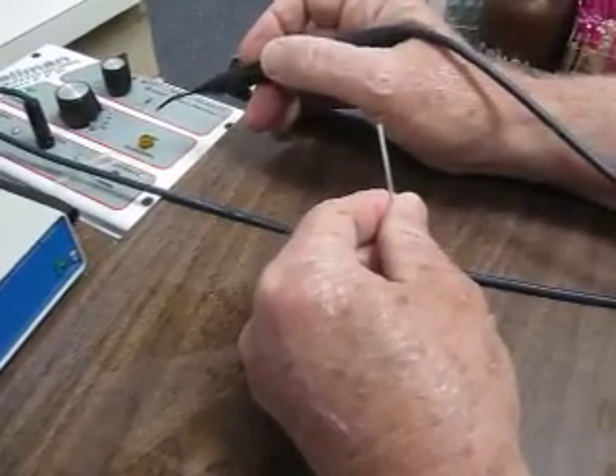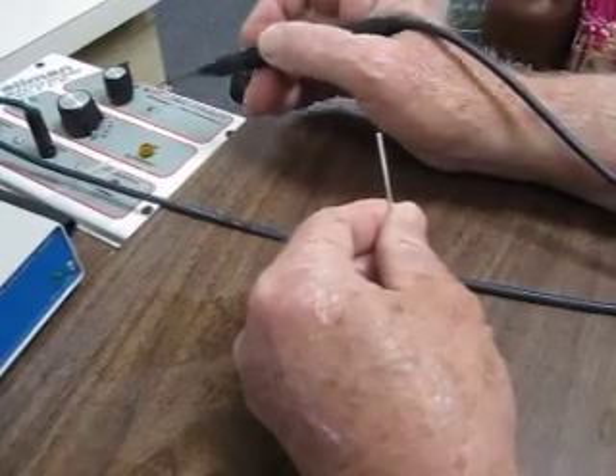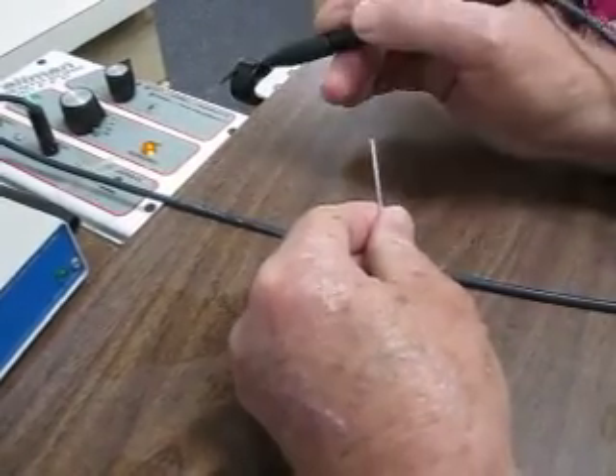Over here, as you can see, there's my electrosurge, and when I step on the gas, the orange light comes on, which means this tip is active.